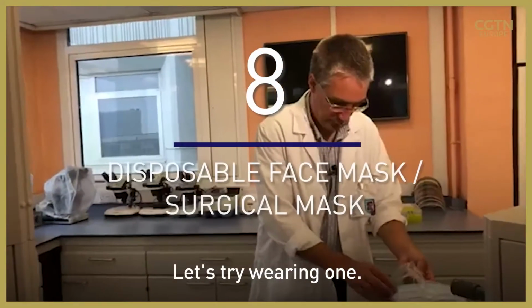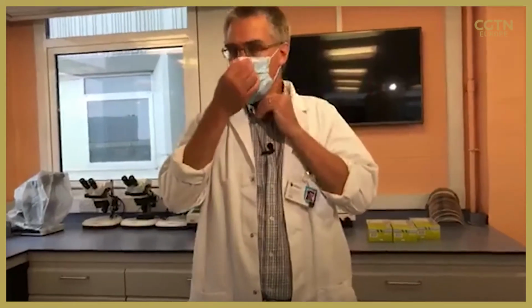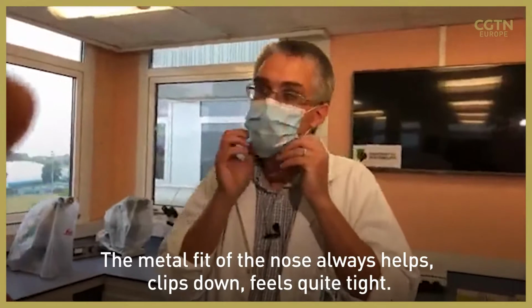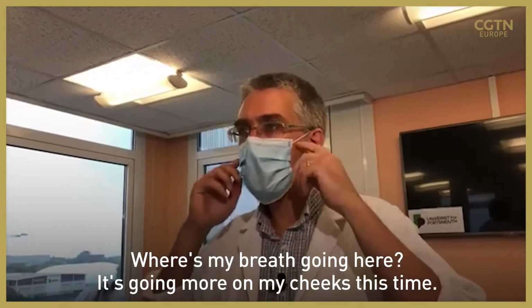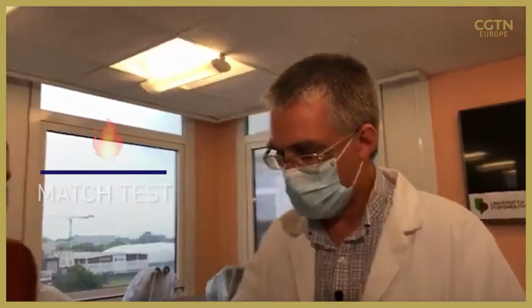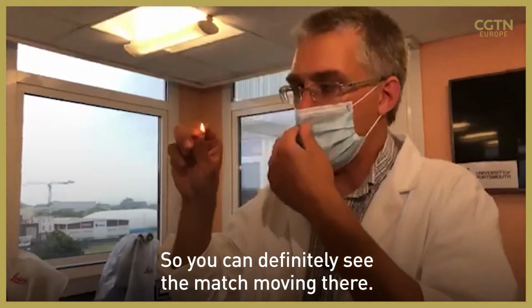Let's try wearing one. Okay, so again, the metal bit of the nose always helps. It clips down and feels quite tight. How's my breath going here? I feel it going more up my cheeks this time. Ooh. Yeah, so you can definitely see the match moving there.